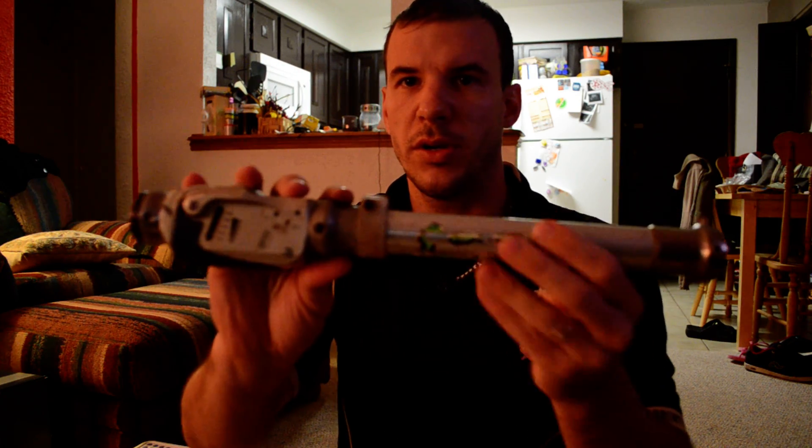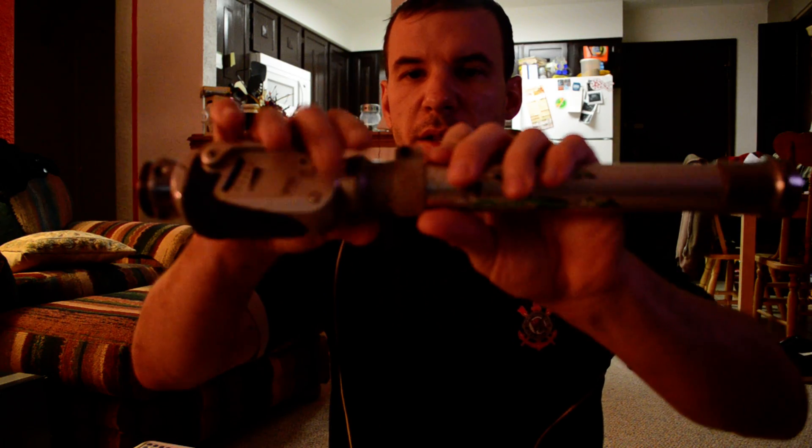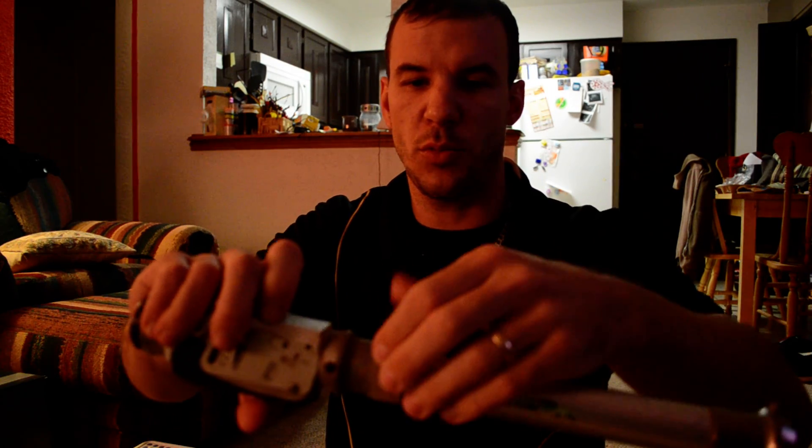The pylon here usually comes a little bit longer. This piece here is an Allen key that comes out, and this piece will come off the pylon and allow you to adjust it. For the purpose of this video, we're not going to get into that.